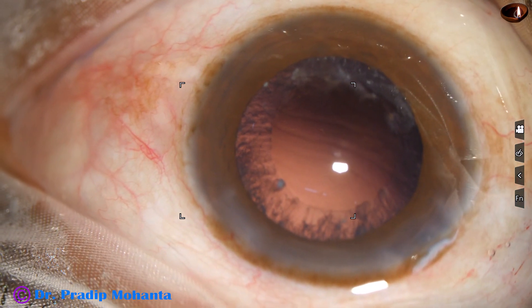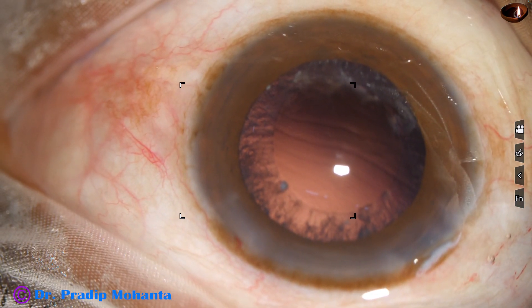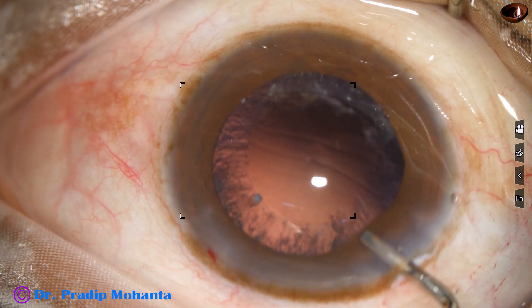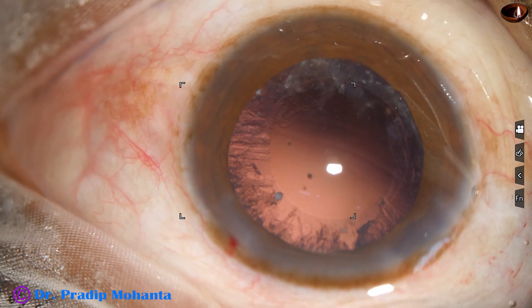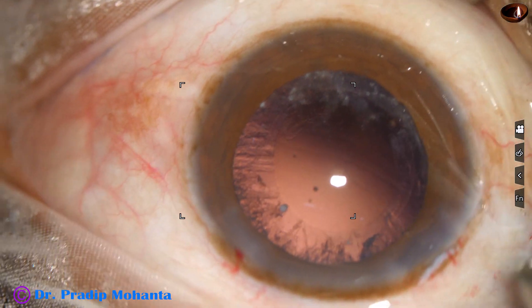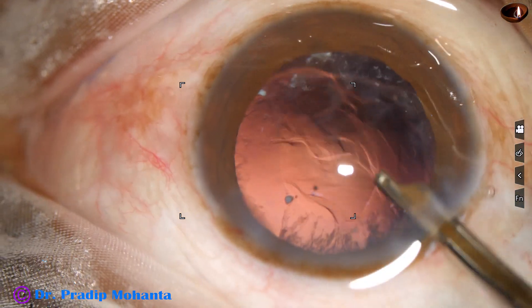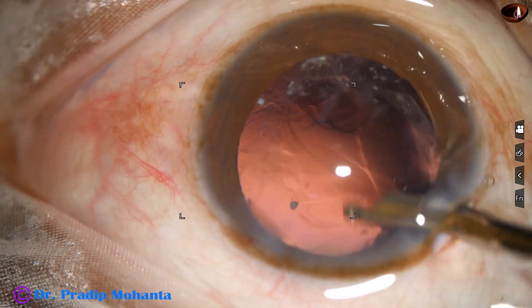Now I have to remove the cortex and implant an intraocular lens. Some visco is injected, and a 23-gauge Simcoe cannula is used to remove the cortex.